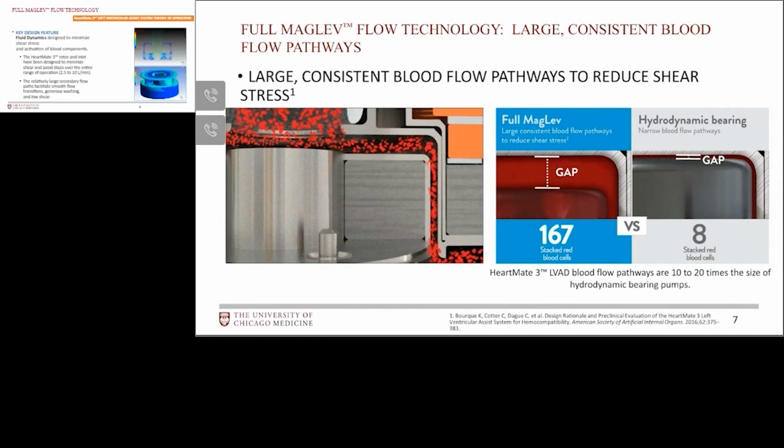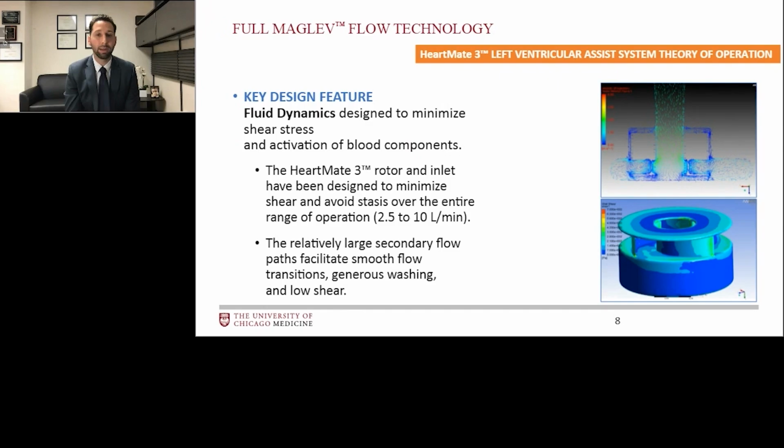And these improvements aren't just theoretical, they lead to real improvements in shear stress. For those less familiar, computational fluid dynamics is a study of blood and blood elements as they pass through a confined space. Here you can see shear stress quantified as blood is passing through the inflow cannula and the rotor of the HeartMate 3.